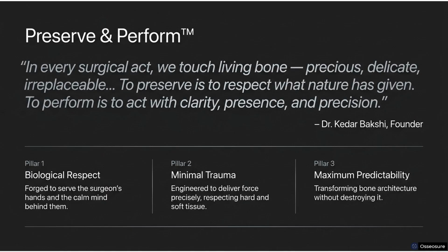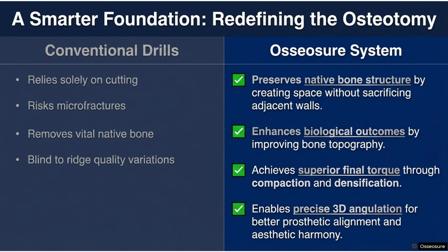OsseoSure helps in all three of these pain points. That is, its foundation: biological respect, minimal trauma, and maximum predictability. Why are we drilling bone? We are drilling bone because manufacturers have not given us any other option. But now that option is available in the form of OsseoSure.